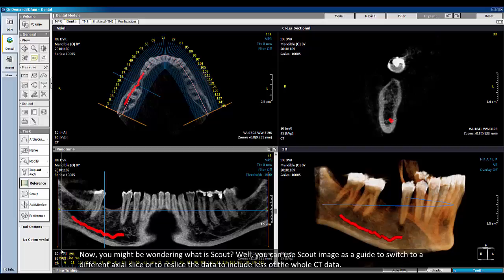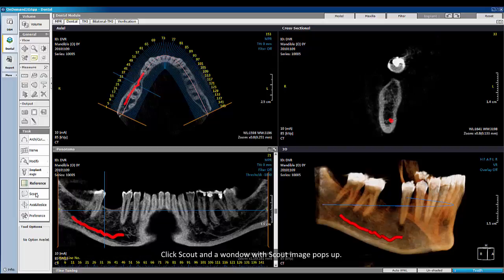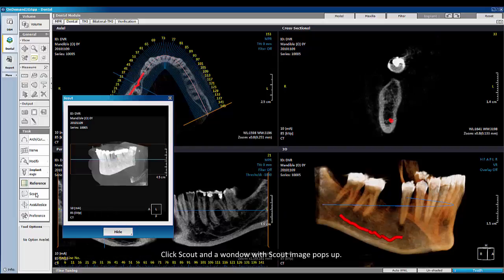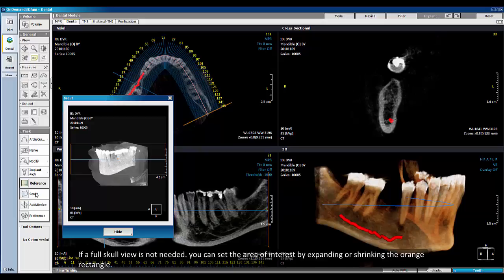You might be wondering: what is Scout? You can use the Scout image as a guide to switch to a different axial slice or to resize the data to include less of the overall CT data. Click Scout and a window with the Scout image pops up. The area within the orange rectangle is the area of interest for the user. If a full Scout view is not needed, you can set the area of interest by expanding or shrinking the orange rectangle.